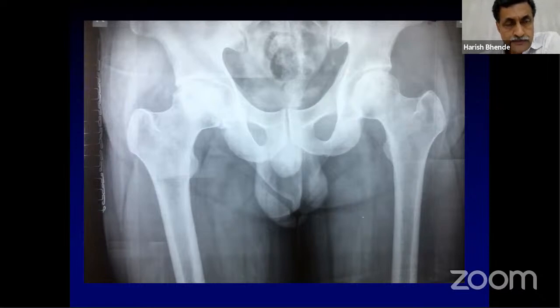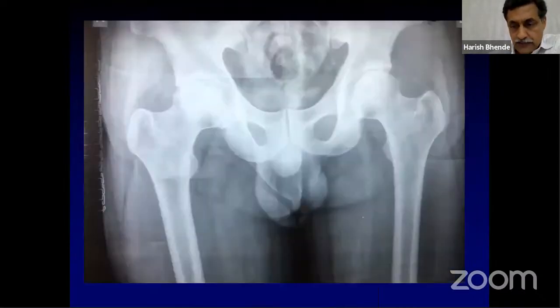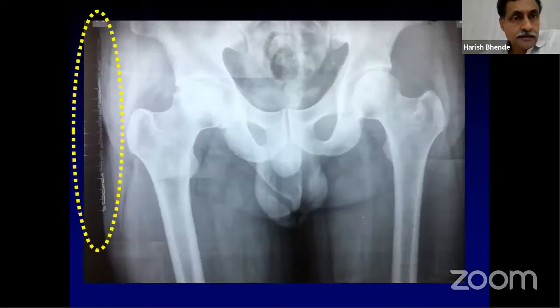And you can see on the left-hand side that this is a magnification strip. Now, how do you make it? It's very simple. You can take those pins, take any plastic scale, which is a 1 centimeter scale, and on each centimeter line, you put a small pin and stick it with adhesive tape. Automatically, each pin is about a centimeter distance.